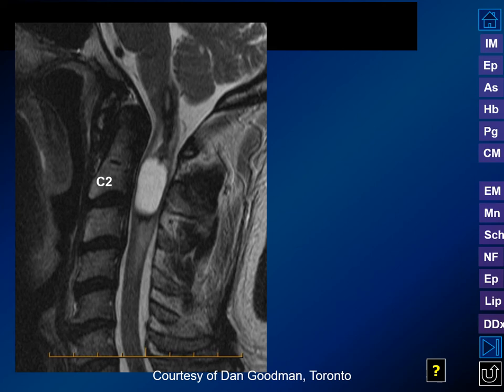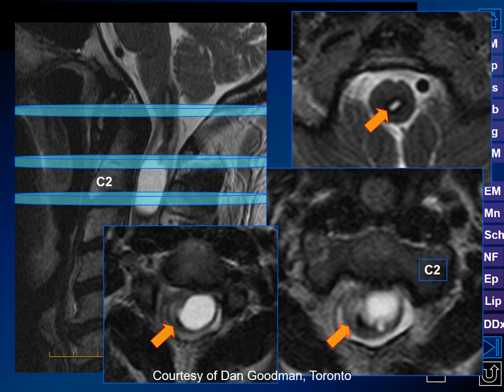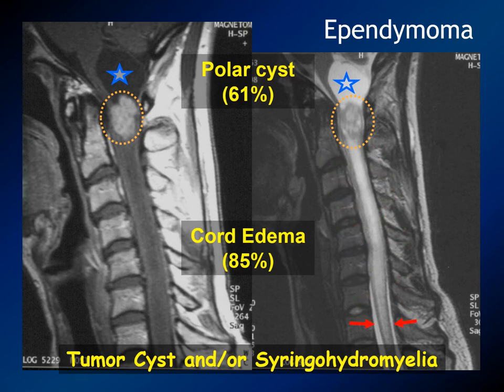Looking at a typical cervical spinal cord ependymoma: we have expansion of the cord, a partially fluid and partially solid mass, with extensive areas above and below appearing hypointense from hemosiderin on T2. The corresponding axial images show a rim of hemosiderin around the outside of the lesion — typical for ependymomas. We can also see polar cysts, the solid portion showing relatively homogeneous enhancement, a fluid-filled area that may represent tumor-related syringohydromyelia or a neoplastic cyst, and edema extending below. This is a very typical cervical ependymoma.